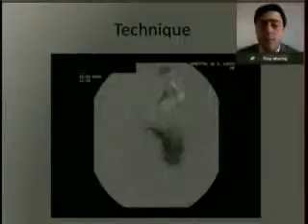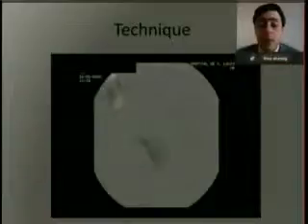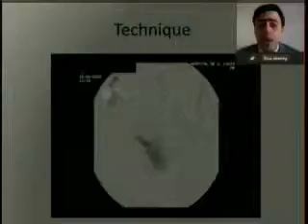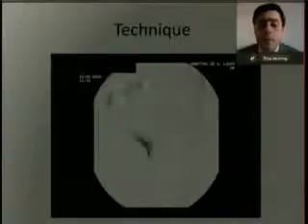And with this point, we are safe to embolize. So here is our first control, still with some vascularization in the prostate. And this is the final control with complete devascularization of the prostate on the right side. So we do bilateral, of course, not the puncture, I mean the embolization.